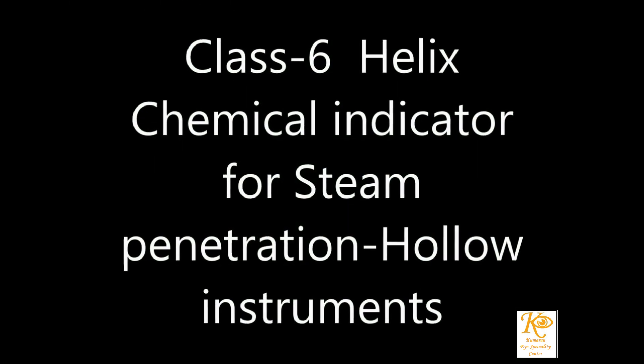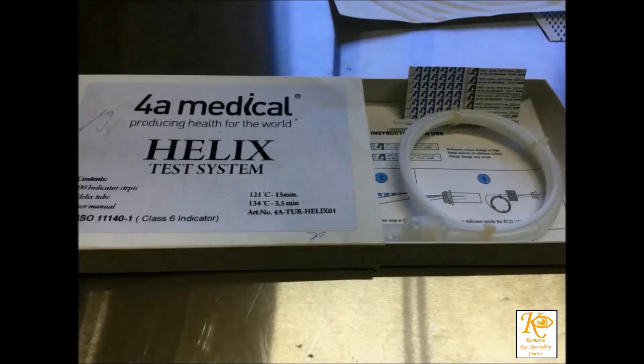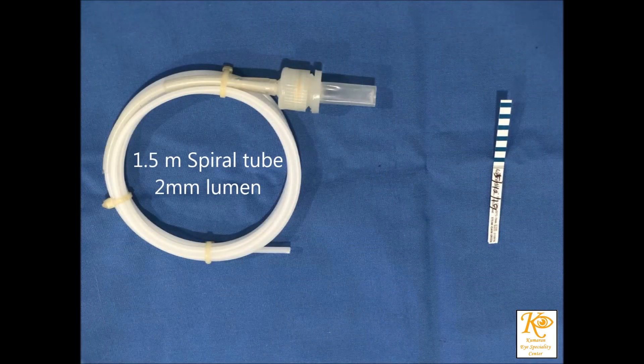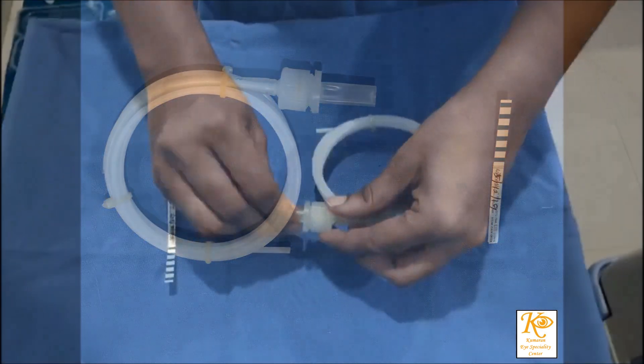The Helix PCT test is used as a daily test for pre-vacuum autoclaves to check steam penetration into hollow devices. The Helix test can be used as an alternative to the Bowie-Dick test.